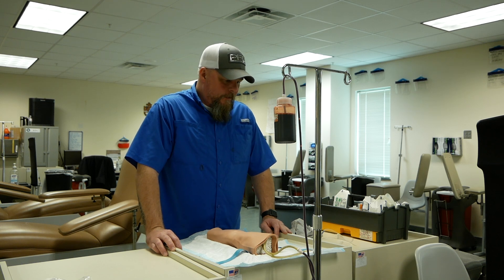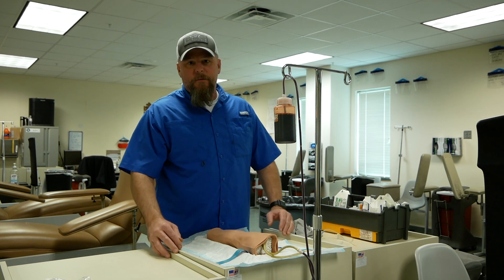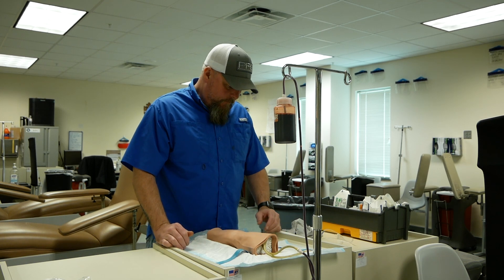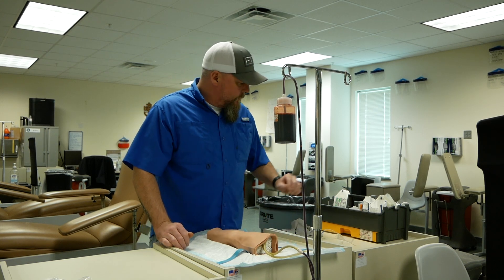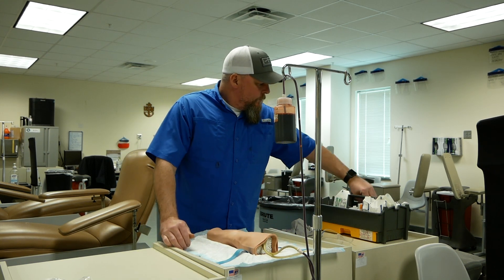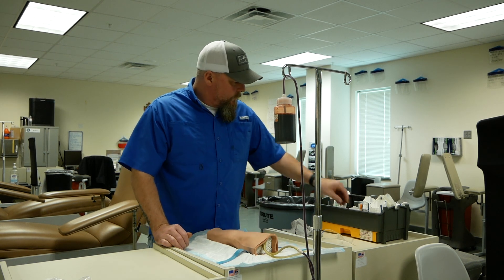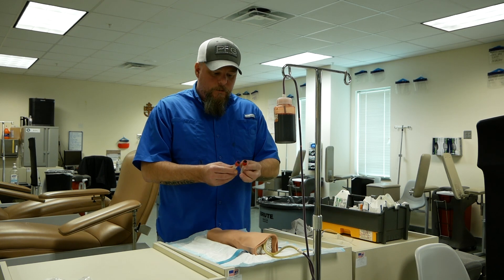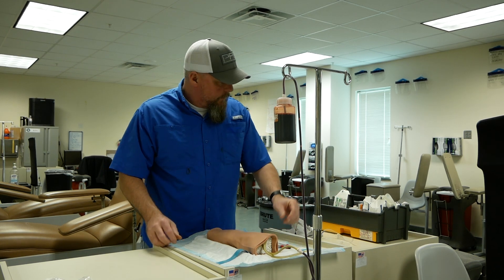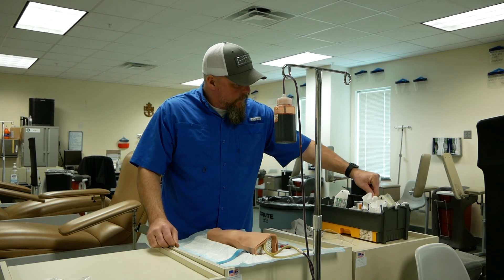If you follow your lab sheets, the very first thing we're going to do is verify the doctor's orders and then go ahead and gather our equipment. For venipuncture, you're going to get a vacutainer needle when an instructor is ready to give it to you. You're going to grab a vacutainer holder and we're going to get two vacutainer tubes of blood. You're going to need an alcohol wipe to clean the site and gauze.